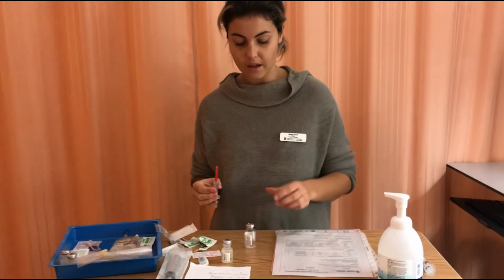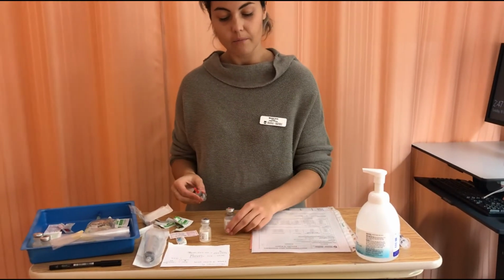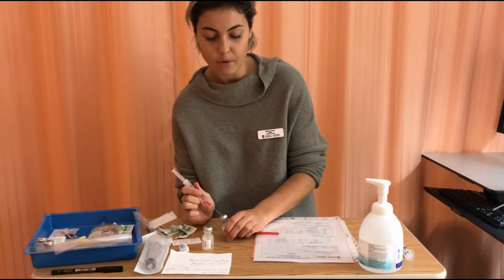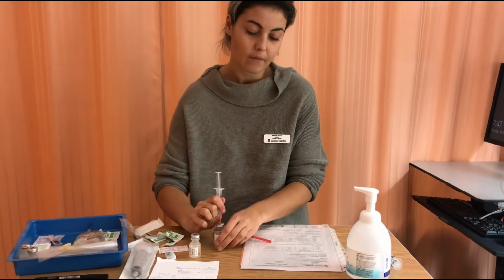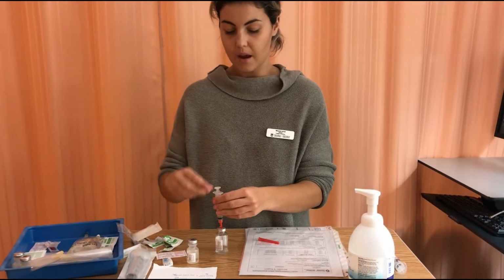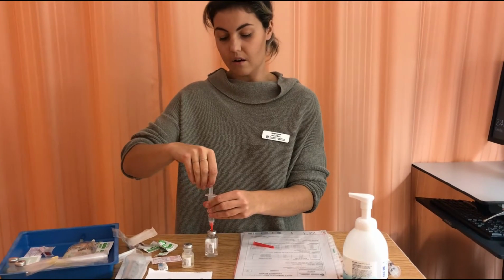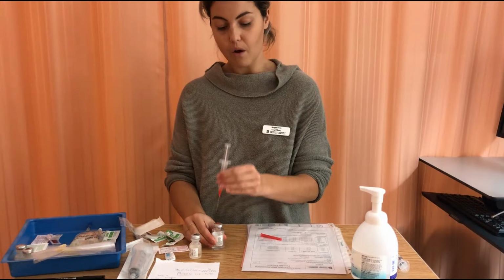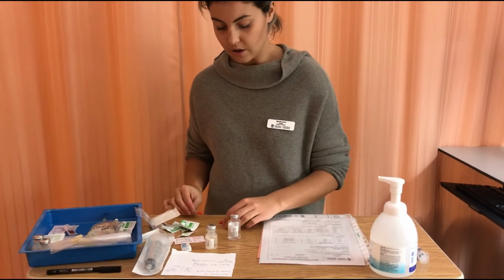And then going to inject it into my penicillin vial. I'm sure that the sterility of the top was maintained, but just in case, if you were worried, you could re-clean the top. And I'm just going to displace the air, the 3.1 milliliters of air for the water that we entered.